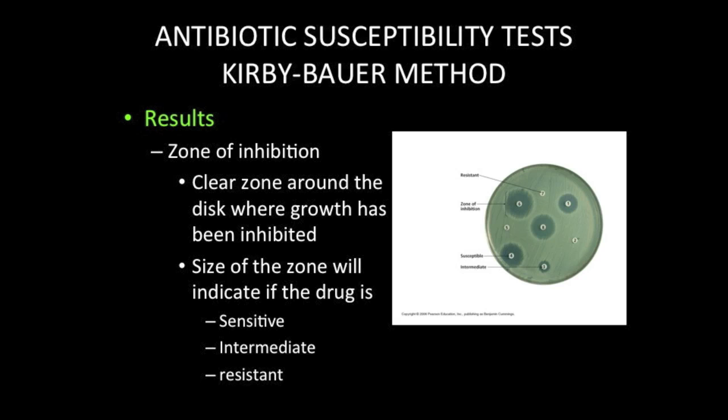A result indicating that the bacteria are resistant indicates that the organism is resistant in vitro, in the lab setting. So if it is resistant in the lab, there is a high likelihood that the use of the drug in a patient to treat an infection would fail.